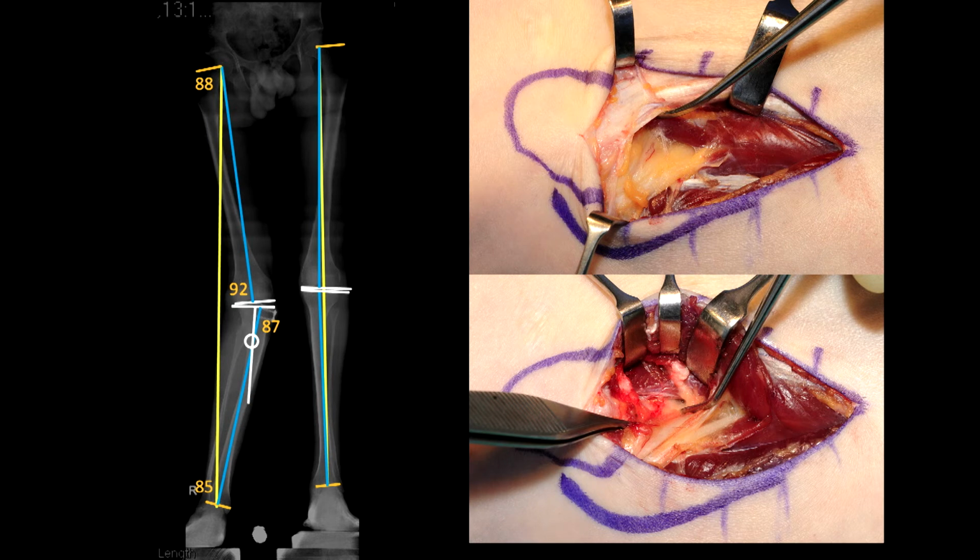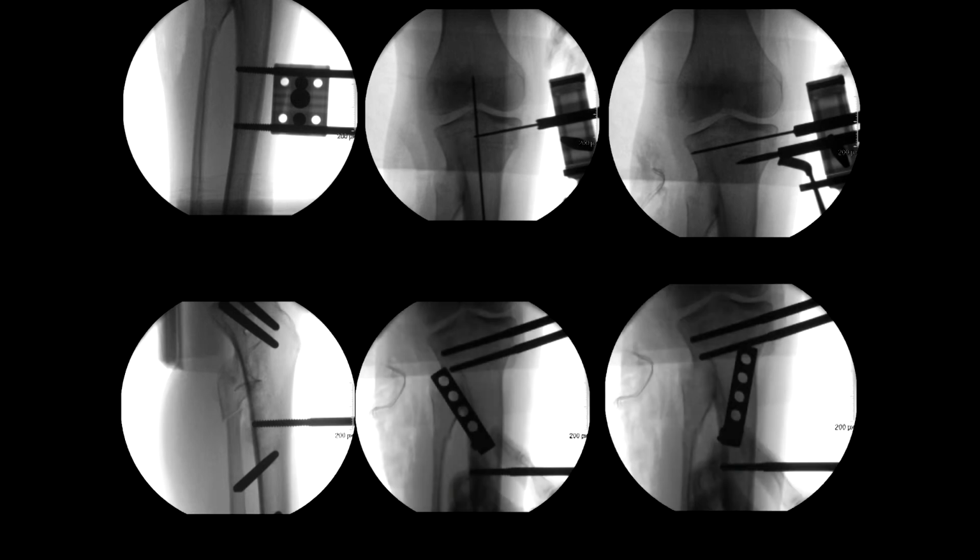And you've seen that there are two techniques. You've got the Paley technique, which is from proximal to distal. We've got the technique we've shown you here, where we try to find the nerve distally first and then lift off the origin of peroneus longus, so you deroof that completely and trace the deep peroneal nerve as it enters the anterior compartment. So here we have the series of C-arm views showing the correction.